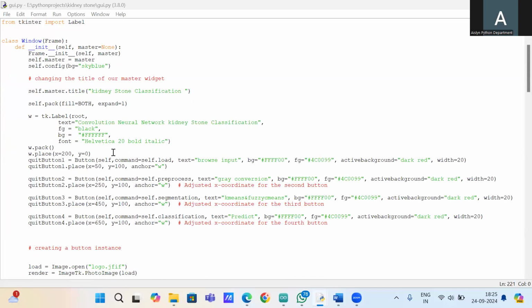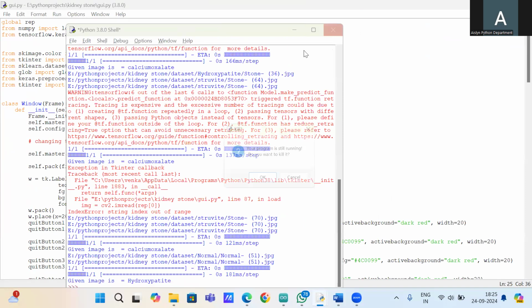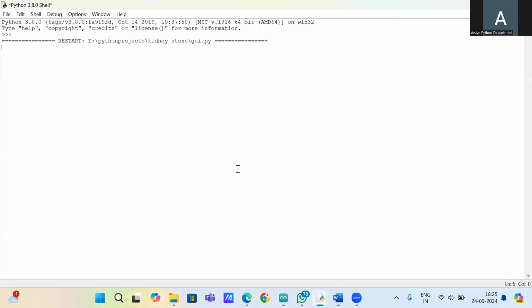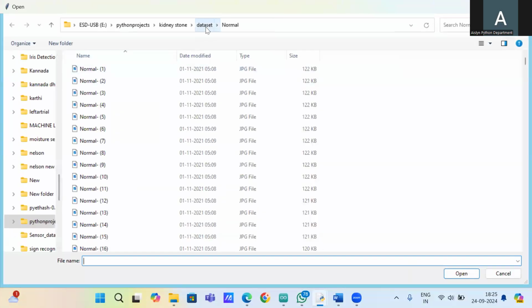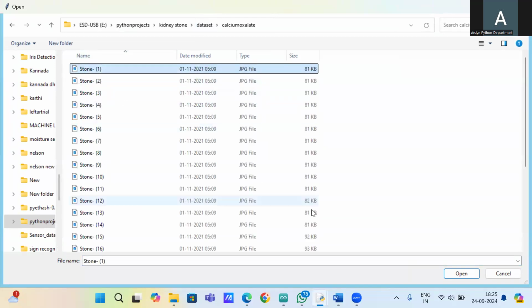Yeah, this is our testing code. I'll run this now. Yeah, this is our GUI. First I will browse the input, any one from the dataset. Yeah, this is our dataset. In this, I will input any class. I will choose this.